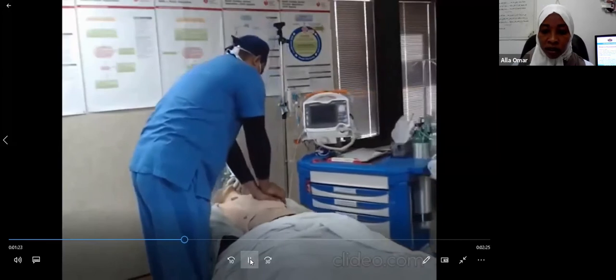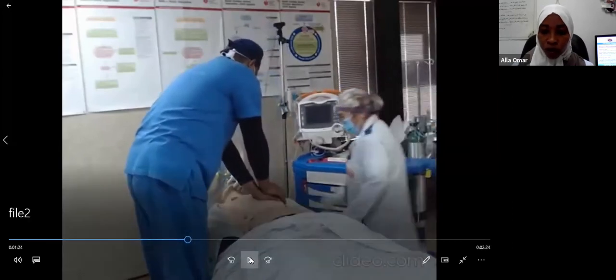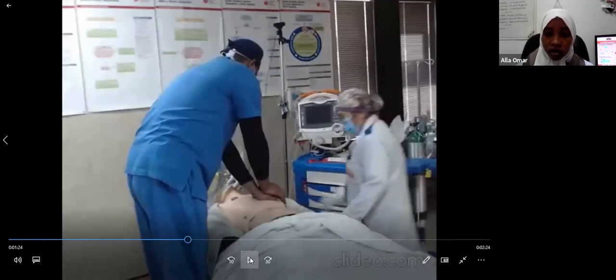See now the second nurse came with our crash cart. As you can see, our crash cart consists of medication. Actually, it is on the top of the crash cart, and the defibrillator is on the top also. In the drawer, we have intubation items, IV items, medication items. We even have an oxygen cylinder for suction and to deliver oxygen also. So all in one crash cart.